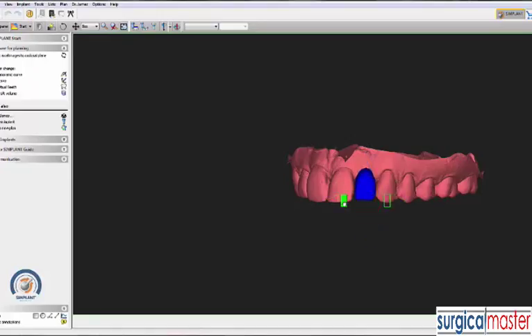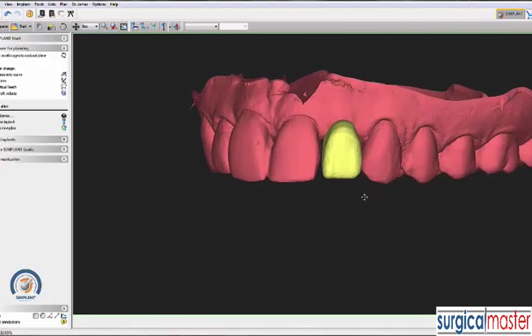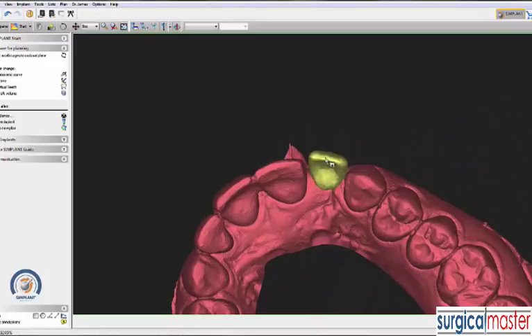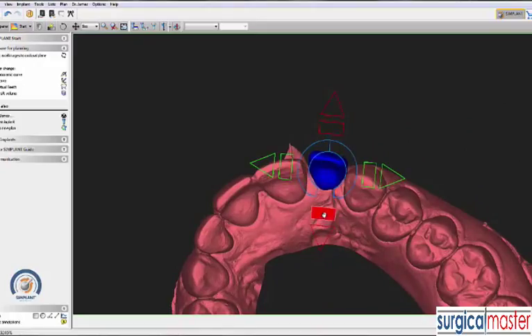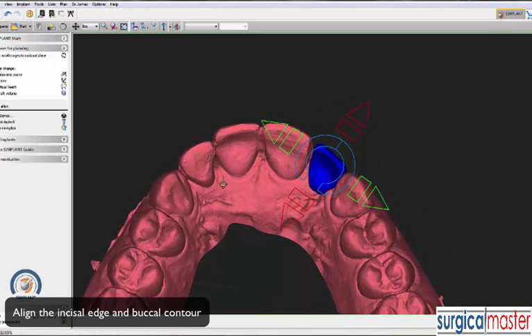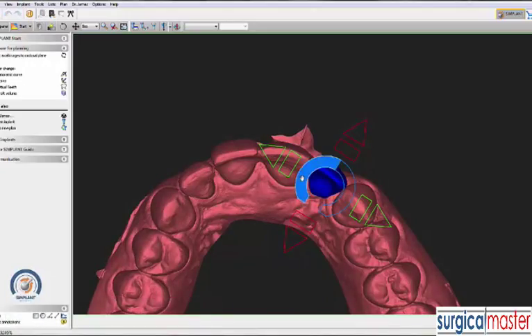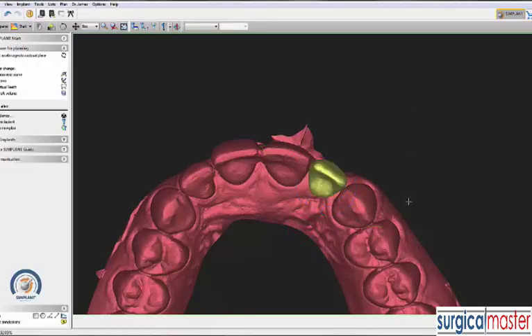We can make it a little bit wider and maybe shorter as well. We won't have an ideal emergence profile because of the deficiency on the buccal. But at the very least, what we can do is align the virtual wax-up so it aligns with the arch and the incisal edge, which is relatively simple to do. If we have multiple teeth to replace, we'd need an actual wax-up as that becomes more complex, but for one tooth it's reasonably manageable.